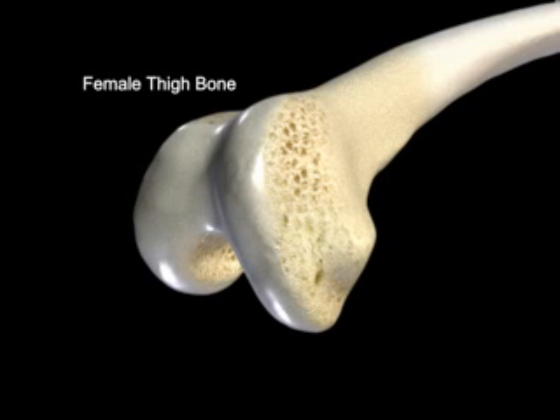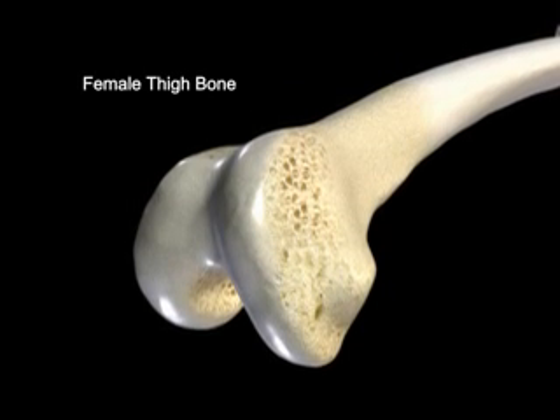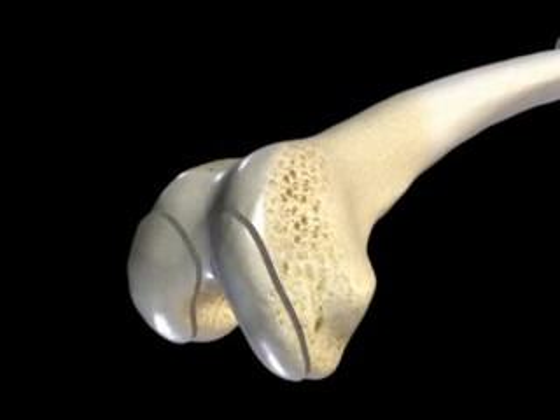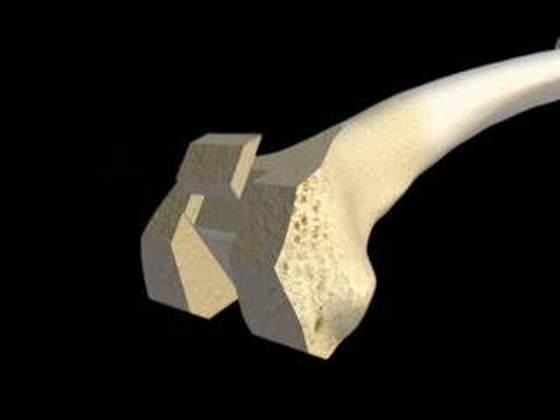This is a model of the end of a woman's thigh bone, one of the three bones that make up the knee joint. By removing parts of the bone, as a surgeon would during total knee replacement, a traditional implant can be fitted onto the bone.